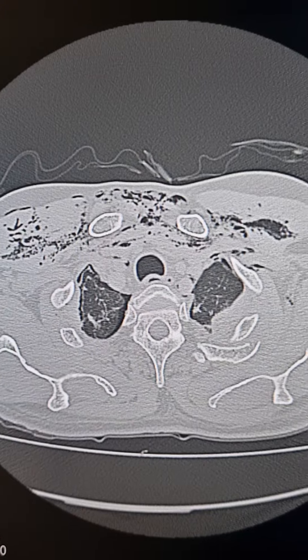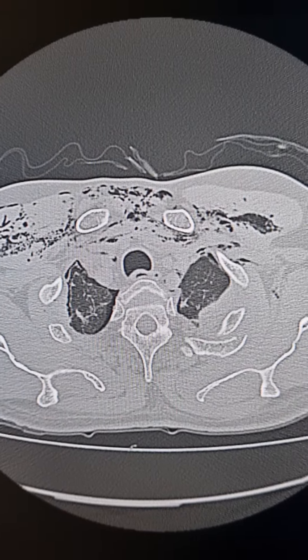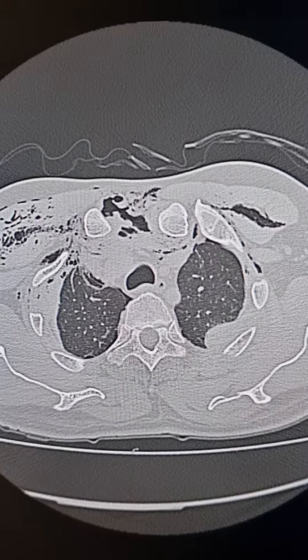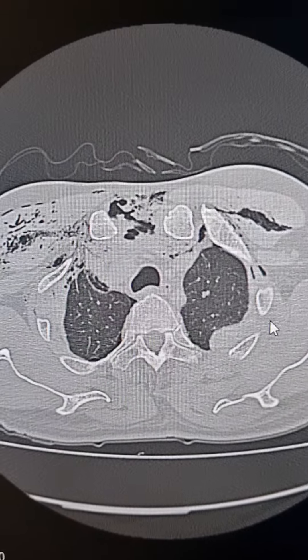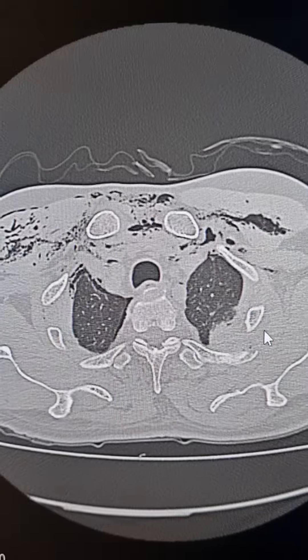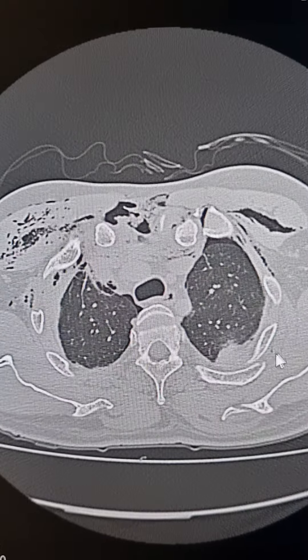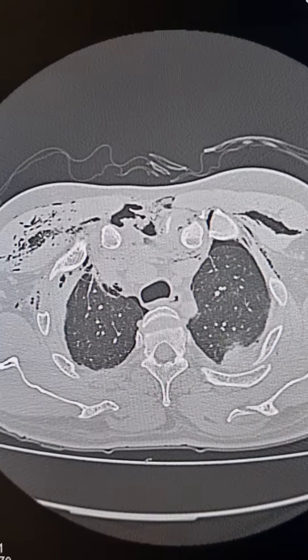There is overlapping. The posterior end of the third rib is fractured, and the posterior end of the fourth rib is also fractured.